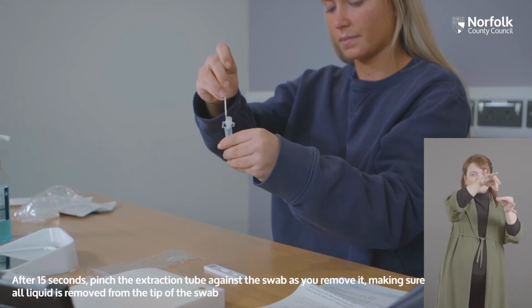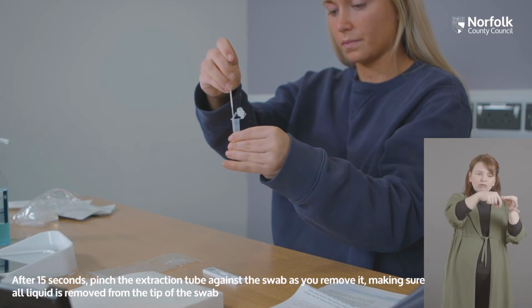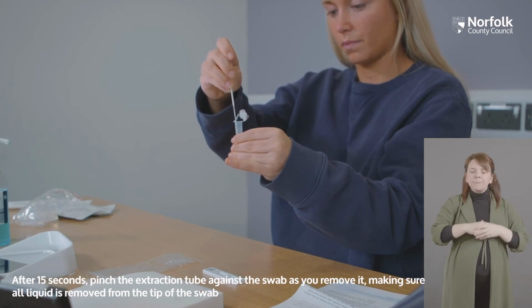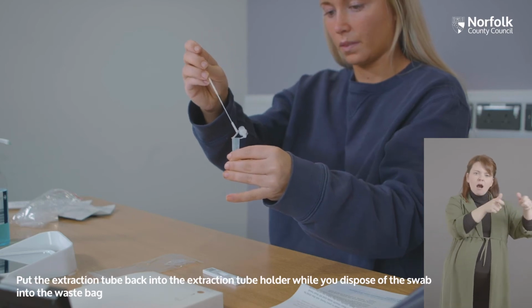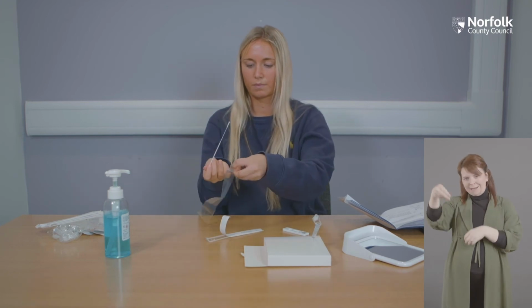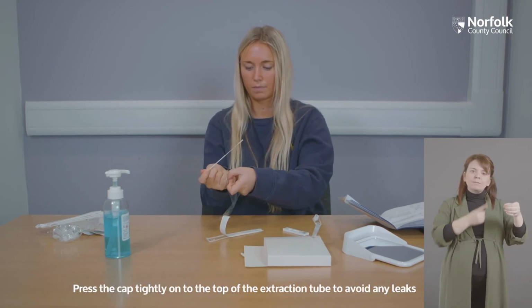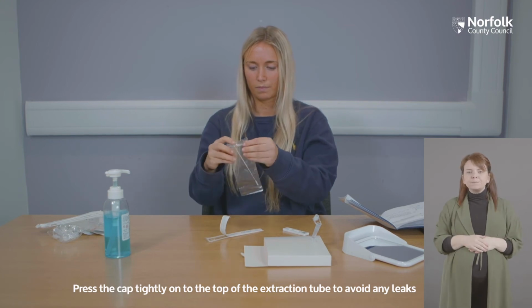After 15 seconds, pinch the extraction tube against the swab as you remove it, making sure all liquid is removed from the tip of the swab. Put the extraction tube back into the extraction tube holder while you dispose of the swab into the waste bag. Press the cap tightly onto the top of the extraction tube to avoid any leaks.